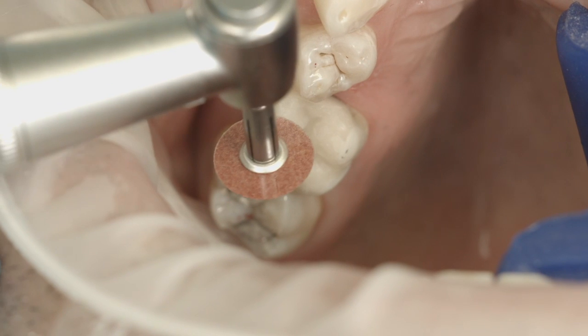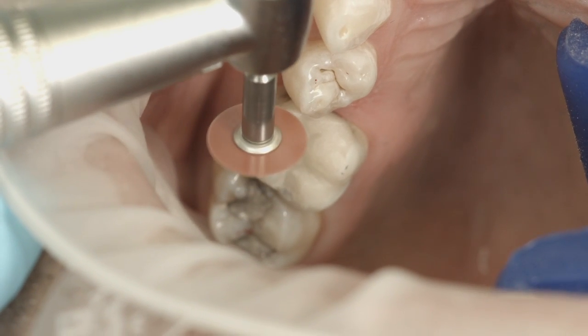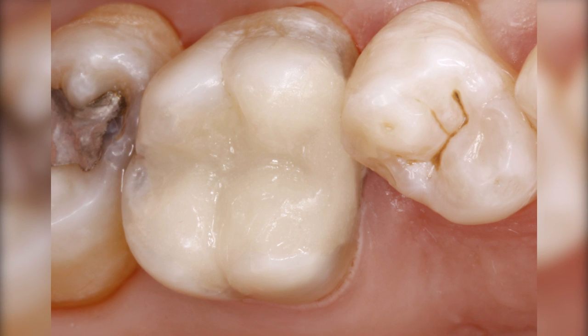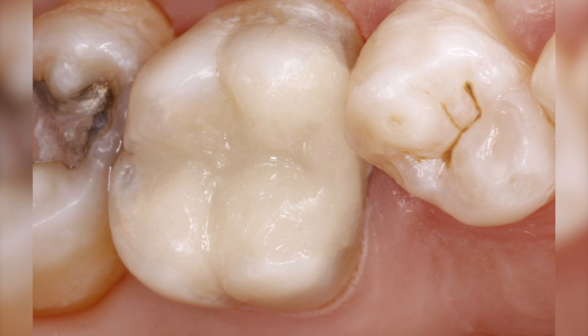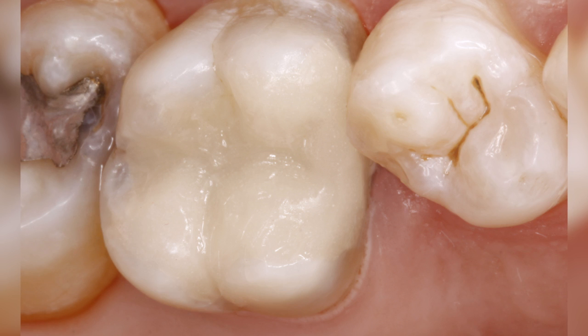Remove excess material using suitable tungsten carbide burrs or fine-grained diamonds and adapt the margins. Use diamonds, tungsten carbide finishers, or flexible finishing discs to remove excess in the proximal area. High gloss polishing is not necessary. The tooth is now restored to its function and tooth-colored appearance. As can be seen at the recall after one week, the restoration blends in well with the rest of the dentition.